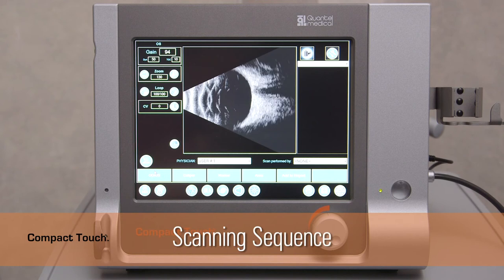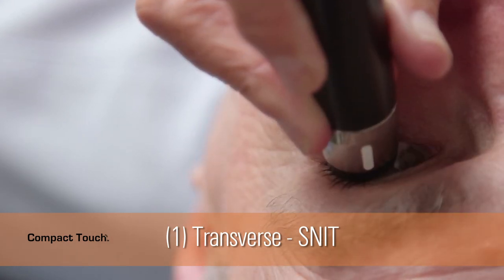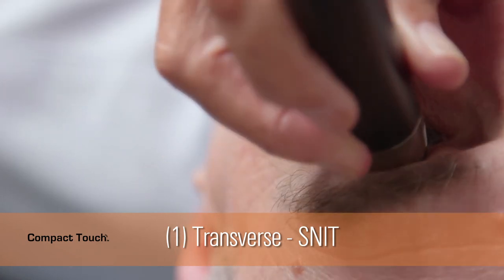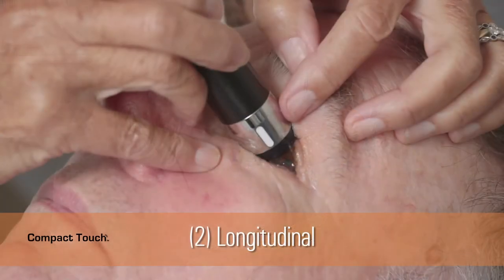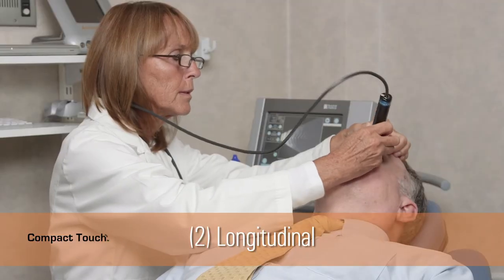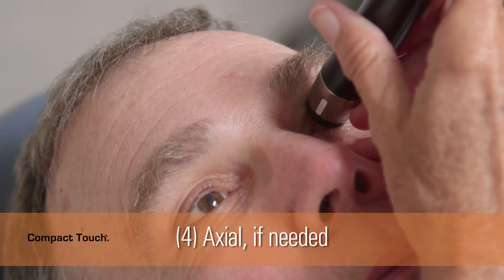The recommended sequence for scanning is as follows. First, perform transverse scans in all quadrants, beginning with the superior fundus, then nasal, inferior, and temporal — remember this with the mnemonic SNIT. Remember to shift the probe from the limbus to the fornix, keeping the face of the probe in contact with the globe and rotating the back of the probe downwards. Then, perform longitudinal scans in any clock hour. For an essentially normal globe, it is generally sufficient to do a longitudinal toward nasal scan to get a good look at the optic disc, and a longitudinal toward temporal scan to evaluate the macular region. Use oblique transverse scans as needed to center areas of interest. Use axial scans only as needed to view the lens and optic nerve.